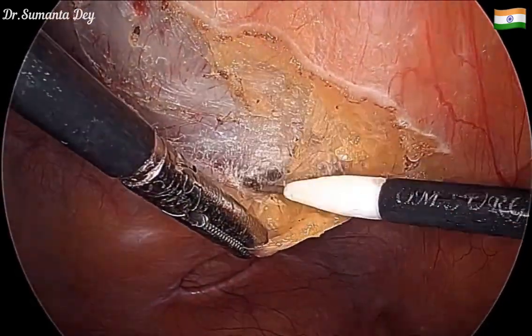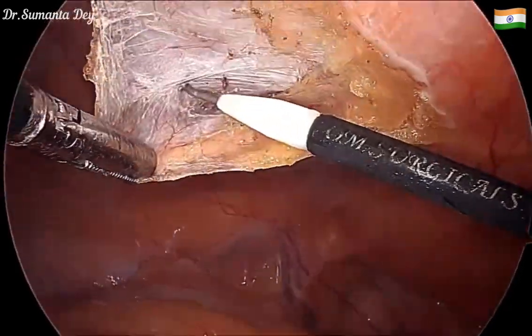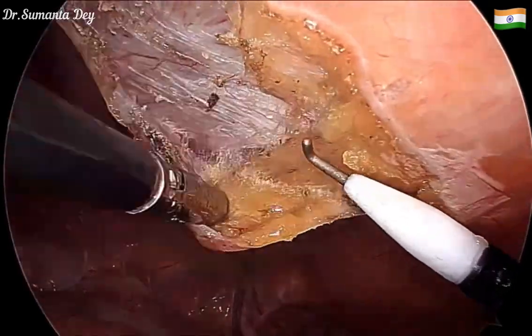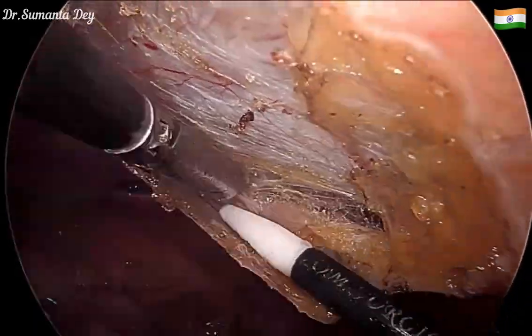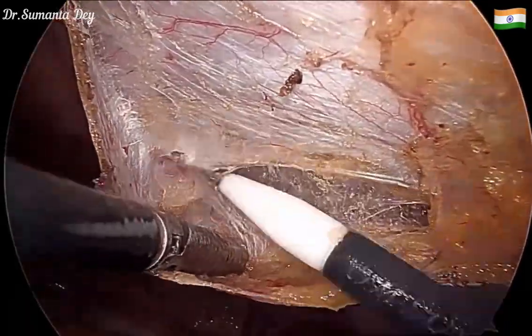This spigelian hernia is located below the arcuate line. Here is the posterior rectus sheath, and below it the sheath is deficient — you can see only the fascia transversalis is present. In the upper part over the posterior rectus sheath, the peritoneum is thin.